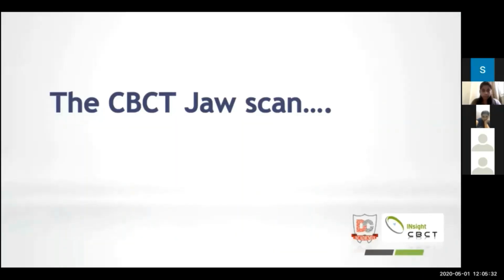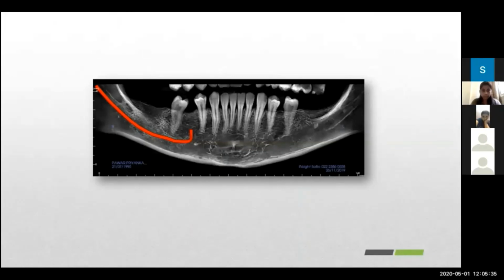So the CBCT jaw scan, this is a particular patient that we have now. This patient's mandible has been scanned, and as we can see on the right side, the right mandibular or the fourth quadrant, we can see that 5 teeth are standing. So we have the first and the second premolar, and there is a gap in between these 2 premolars, and there is an edentulous space distal to this premolar as well. So we would like to, in this case, plan an implant in the 4-6 region or the mandibular first permanent molar.